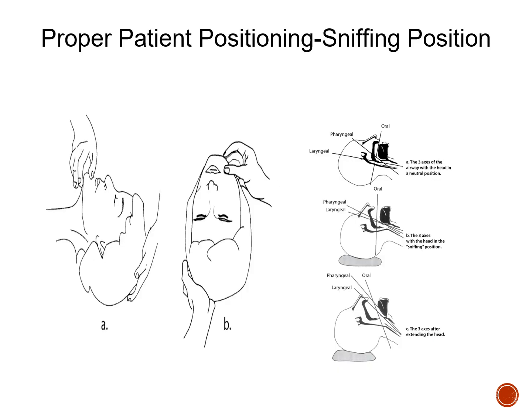This slide focuses on establishing and hopefully maintaining proper patient positioning in the sniffing position. On the left-hand side, you actually are putting that patient in the sniffing position, A and B, just from two different angles. And then on the right-hand side, you're showing that lateral angle, if you will, to see how well putting the patient in the sniffing position can help align the airway opening, the mouth opening, with the glottis. You don't have to lift as hard, and it's much easier to establish visualizing the glottis and to successfully intubate.